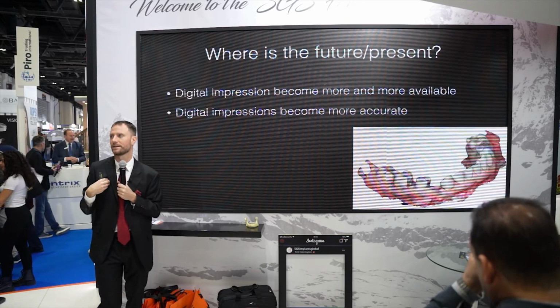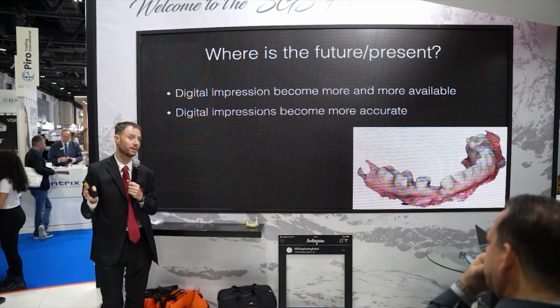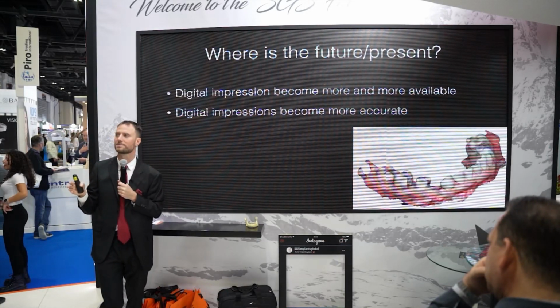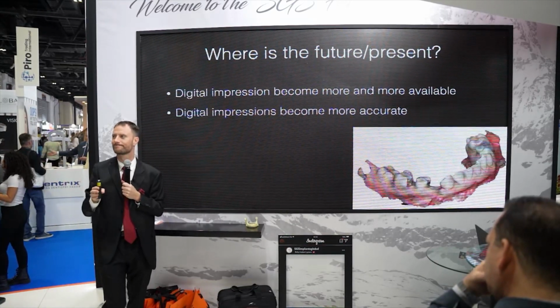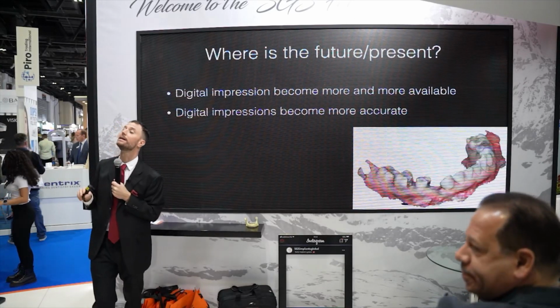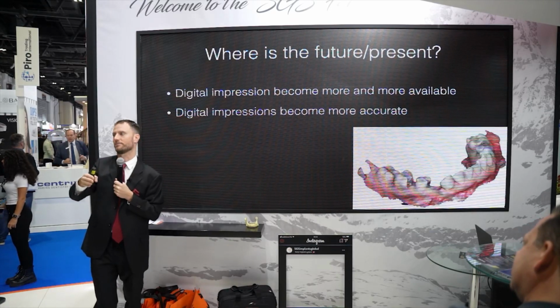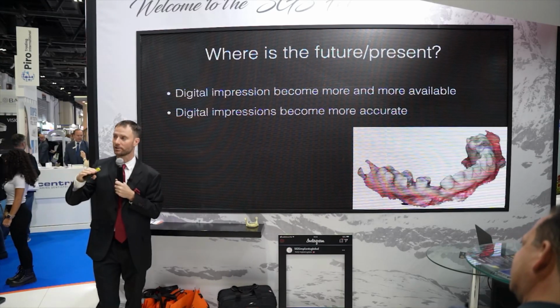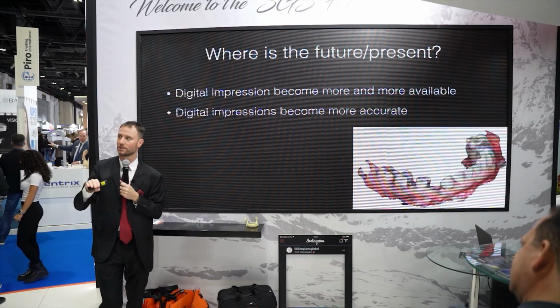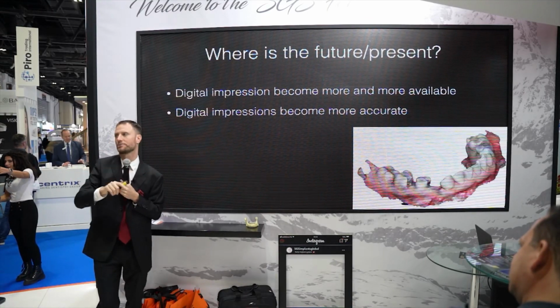There is a limitation. What I think is a full arch restoration, the same as I told you with the full arch implants with no teeth, the accuracy becomes less and less precise. Yeah, they don't really suggest it. They say it's safe. I haven't seen a study showing independently they are safe. You know, with a lot of practice, with exactly fitting staff and personnel and practice, you may be as good as any dentist is with an open tray impression.